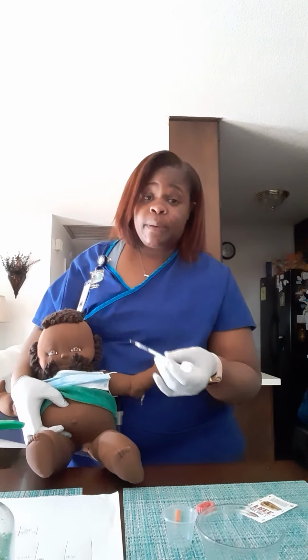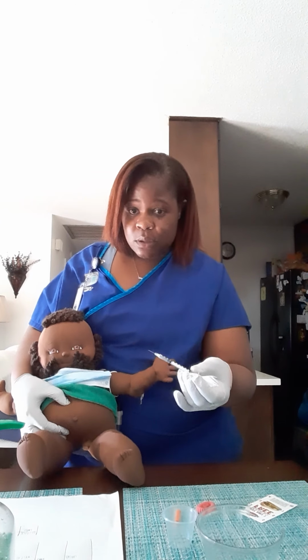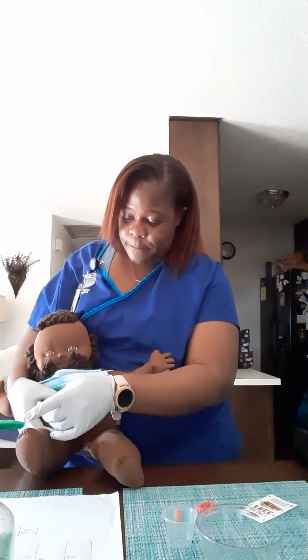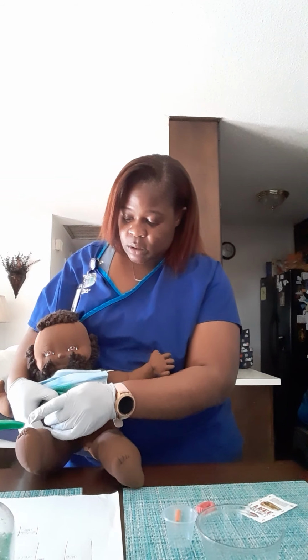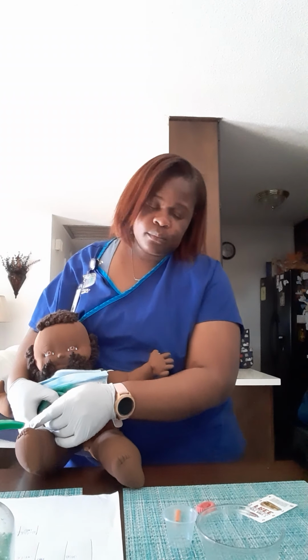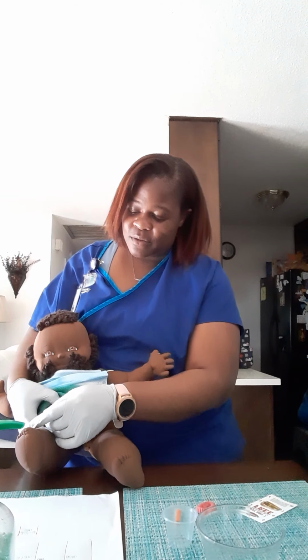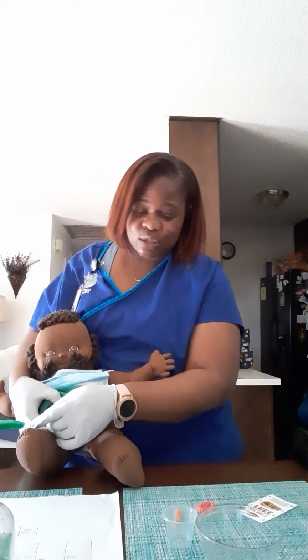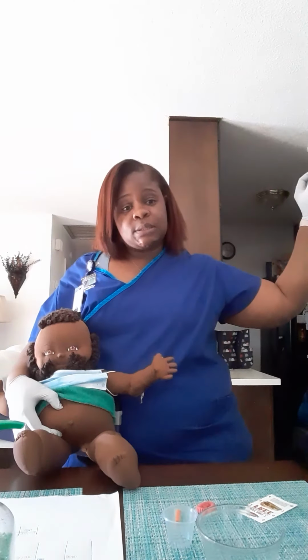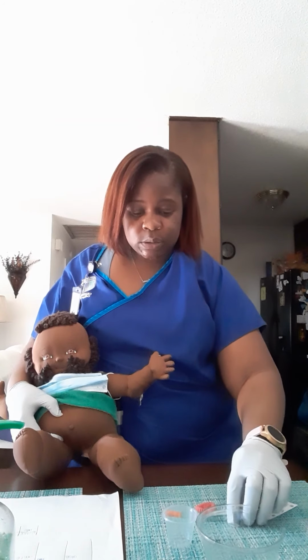And I'm going to let the patient know that I'm about to stick him so he's not surprised. And I'm going to go in at a 45-degree or 90-degree angle. I'm going to push in, gently insert, put in the medication, which is the Lantus, and pull the needle back out. I would put the safety lock on, which this one doesn't have, and then I would put it into the sharps box.